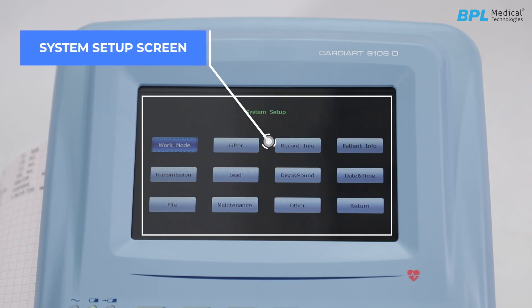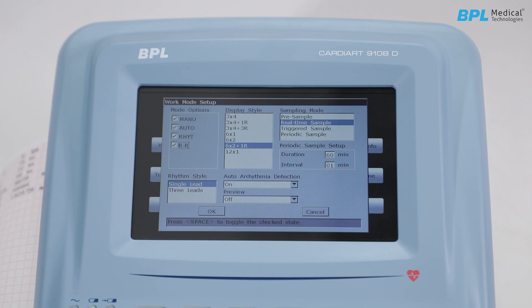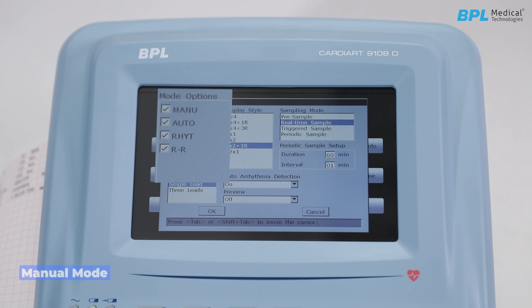In the system setup screen, the first option is work mode. Press Tab or Shift+Tab to move the cursor among checkboxes and press Spacebar to select. There are four mode options: Manual mode, where sampling, filter, and print can be adjusted manually and ECG data of arbitrary length can be sampled. Auto mode is the default and most commonly used, where 10-second ECG data can be sampled, analyzed, and printed. Rhythm mode allows one or three lead ECG waveform to be sampled for a long time, mainly used to diagnose frequent arrhythmia. RR Analysis mode uses the time interval between two successive R-R waves to calculate HRV (heart rate variability).